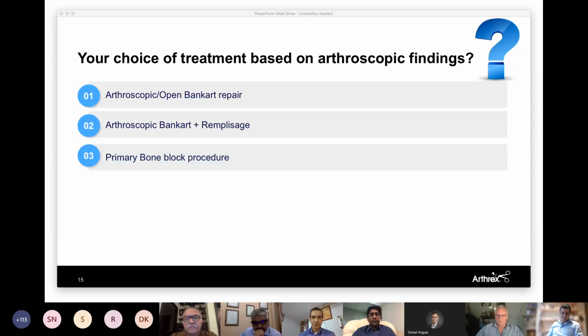Usually we try to calculate HSI, but anyways, in this case, looking at the findings. Yeah, HSI was 11 mm. It's the same Hill-Sachs index. When you say 11 mm, is that the length of it or the depth of it? Did you measure this beforehand? Length. The length doesn't really help us much, does it? I don't know of any indication based on the length of a Hill-Sachs. Sommer and most of all the Hill-Sachs indices all work on the depth.